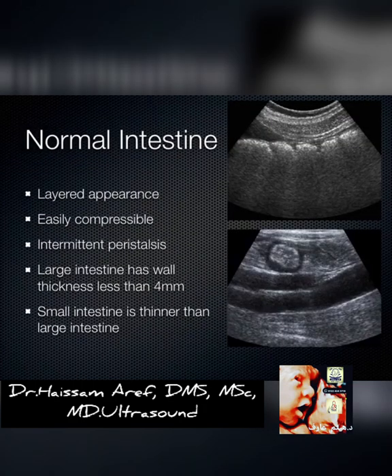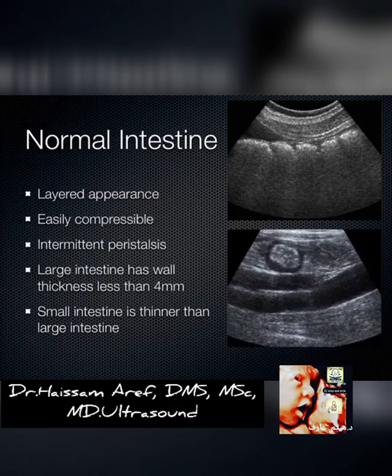Normal intestine shows a layered appearance and is easily compressible. When you compress loops of bowel they just squirt closed — no problem. They peristalse every 10 to 20 seconds. With disease states of the bowel you can see hyperperistalsis initially, and then eventually aperistalsis, or no movement at all.